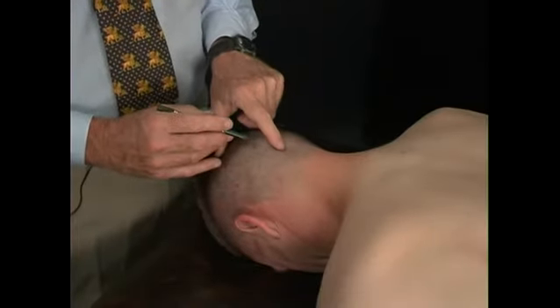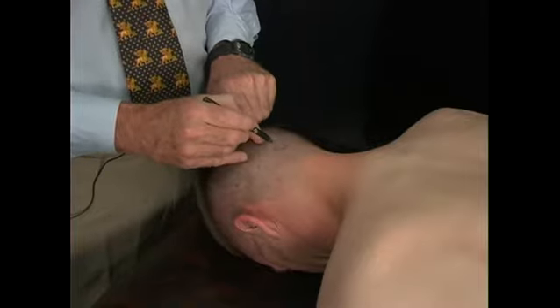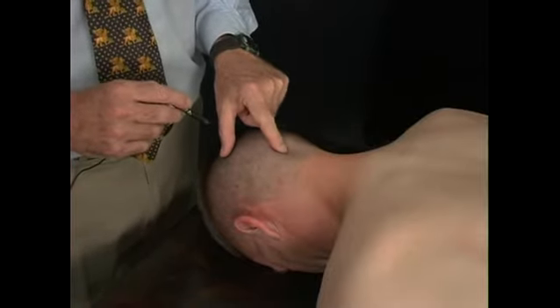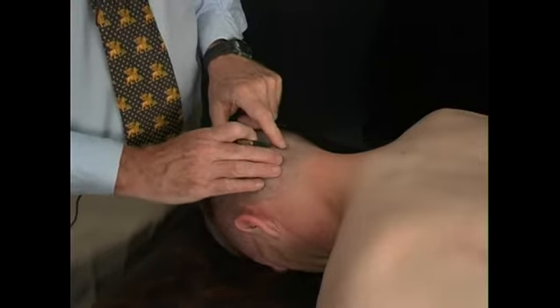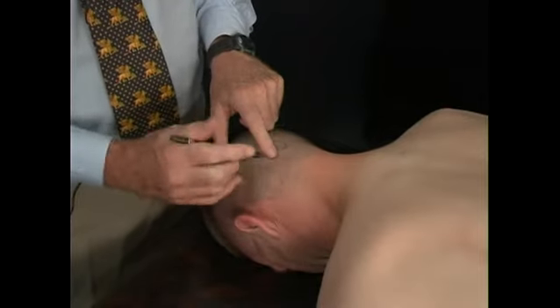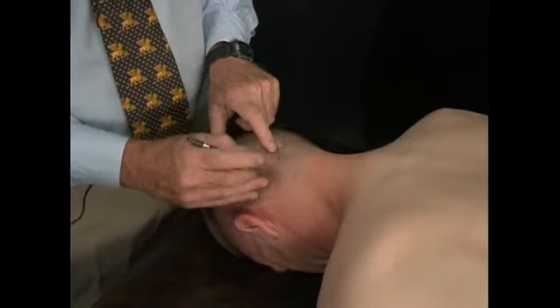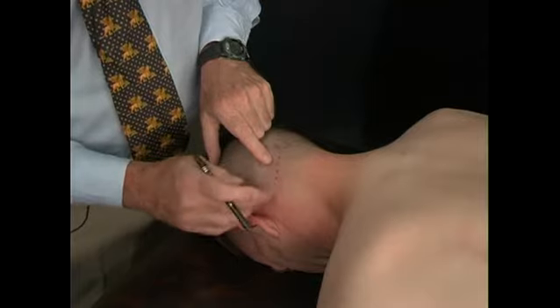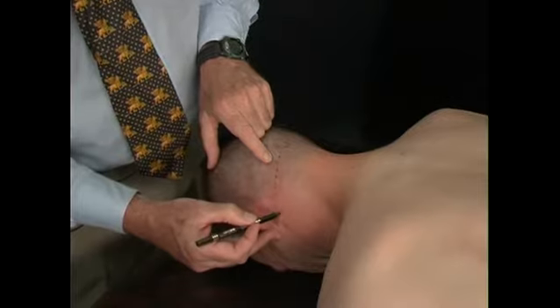We want to identify the midline, what we call the no man's triangle, the area in the middle where there's obviously space. We don't wish to put a needle in this area. Oftentimes I'll keep my finger in this area to keep my needle out of the area. We then want to identify the nuchal ridge where the skull turns and the attachments of the trapezius muscle lie along this area. We can mark this. And he has a rather indistinct nuchal ridge coming down along the side right to the mastoid being here.